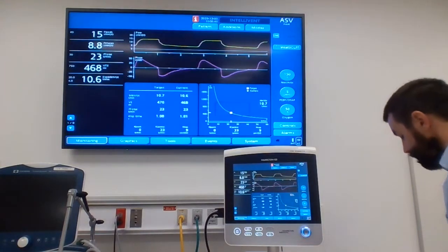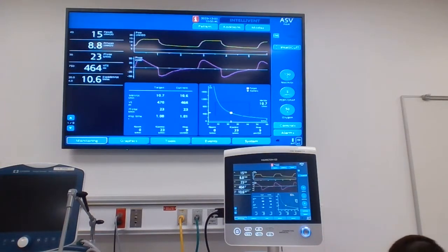All right. Let me change my compliance again. Hang on, I lost the screen.